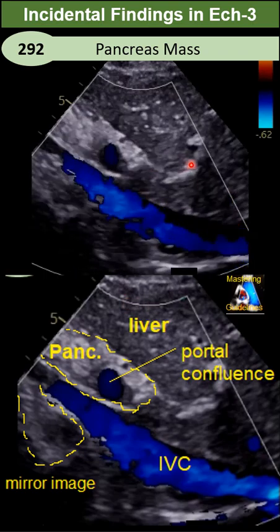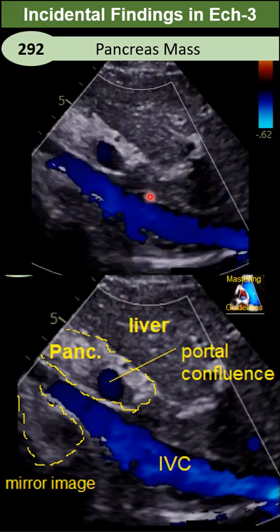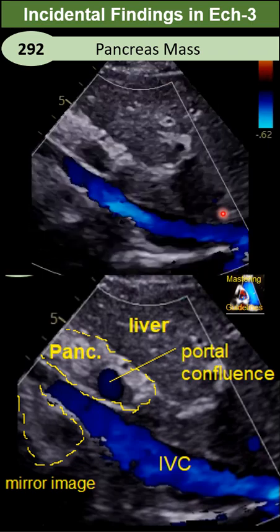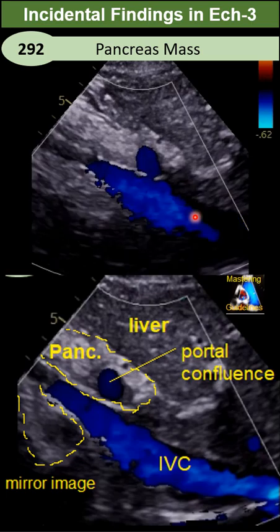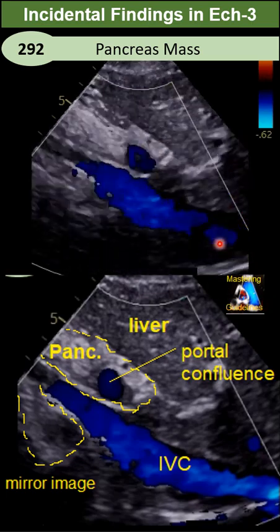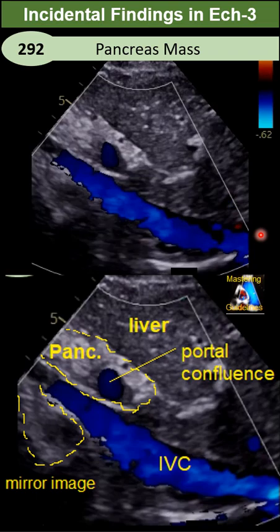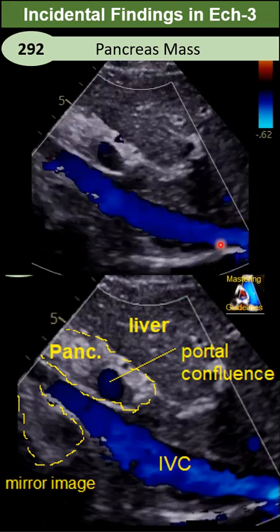This is IVC because it has irregular size and thin wall, and with the respiration and heart cycle, its size and wave shape change. You can see it on aorta shortly: a straight cylindric shape and thick wall, and pulsation and color Doppler help you a lot. And if you angle up, fanning up, you see the IVC joined to the right atrium.